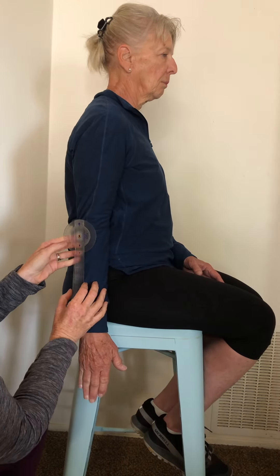For elbow extension, it's in the same position here, same alignment, and she's going to go back down to zero.